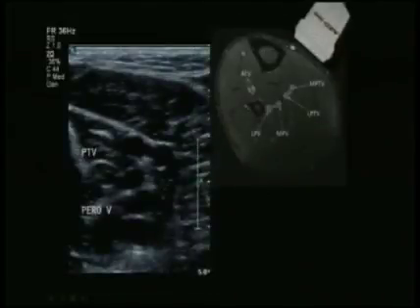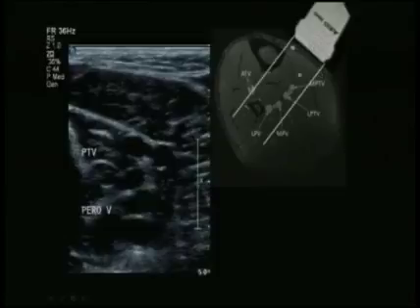If you look at this cross-sectional image, keep in mind that when we scan from a medial approach, usually when we're in the calf, here is your line of sight. These are the posterior tibial veins and the artery. These are the peroneal veins and the artery. Here are the bony landmarks. Here's the tibia. This is the fibula. This is what you would see from this projection.